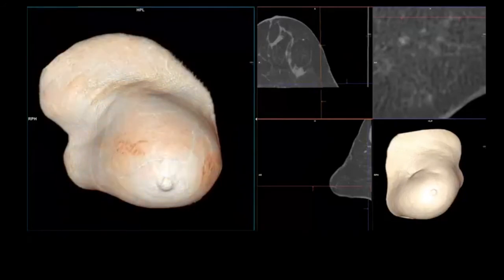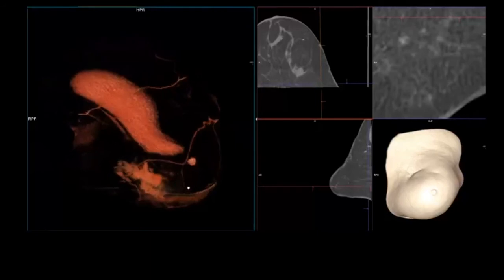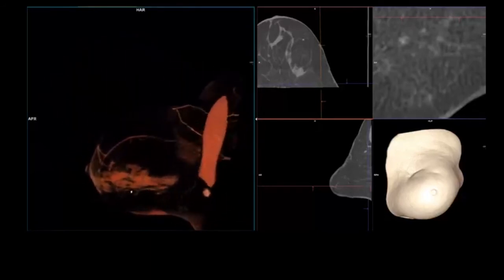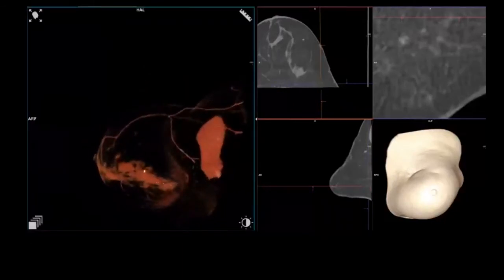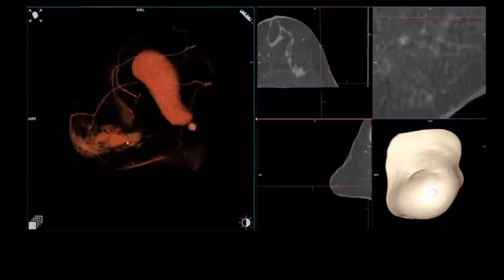So we take away the cutis. By the way, this is all done in real time to see microcalc and the tumor, which now looks really suspicious and malignant. It takes contrast. It has small unsharp delineation.